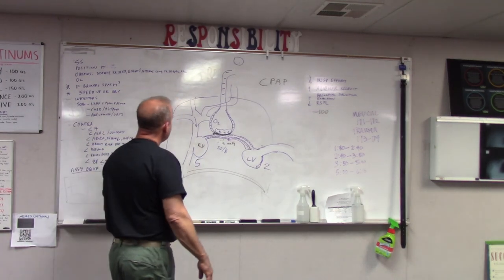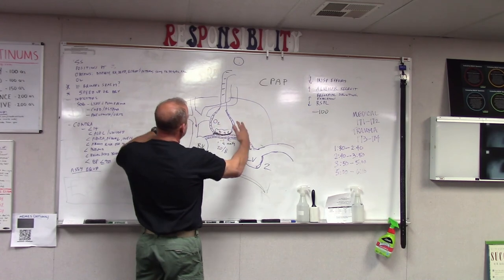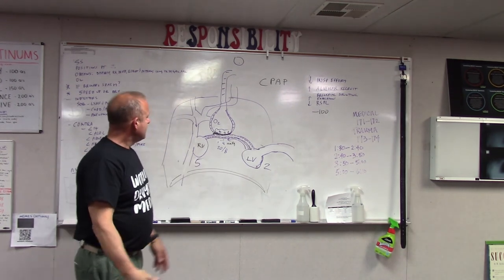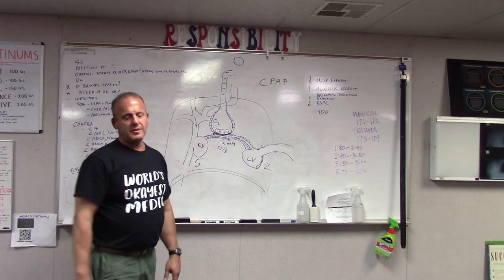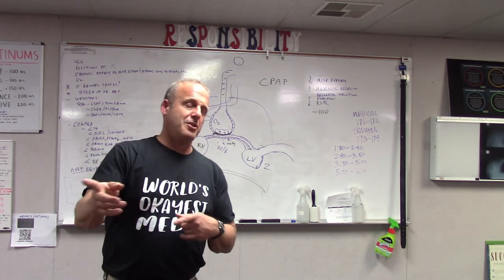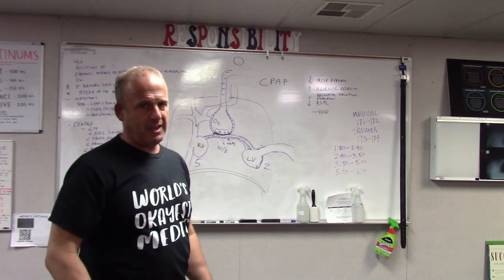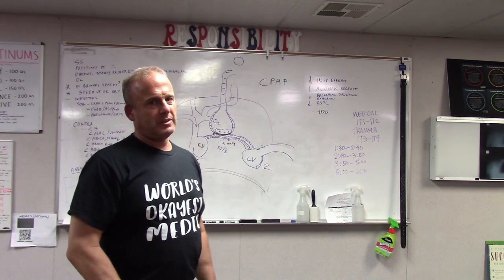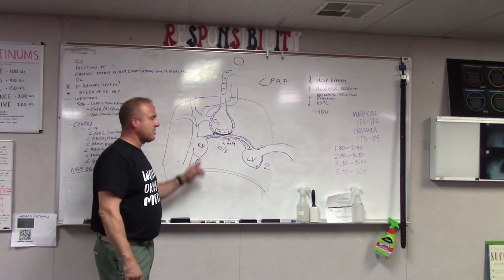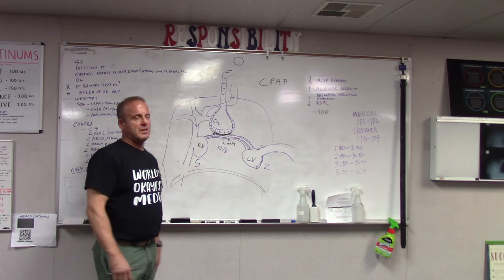If you have a tension pneumothorax, as that intrathoracic pressure builds, there's a massive pressure gradient. Guess what you die of? Right heart failure, obstructive shock. If your patient has a tension pneumothorax and one of you is moronic enough to start bagging them, guess what you'll do? PPV will make the tension pneumo worse. If you apply CPAP to them, same principle. Now that reduction in preload to the heart, which was therapeutic for the pulmonary edema patient, is excessive, and you kill the patient.